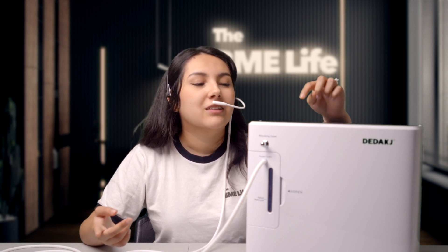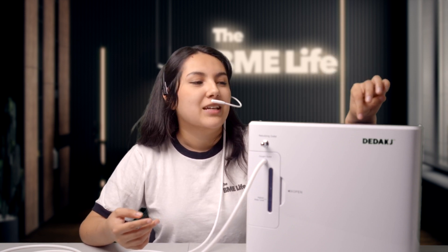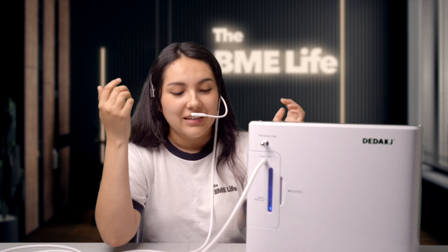It also comes with a button for asking for help from people around you — when you click it, it says 'I need help,' which is pretty nice. I'll just turn it on now — and it starts working. I can feel the air coming in, and like I said, you can adjust the flow to adjust the purity. And that's pretty much it.